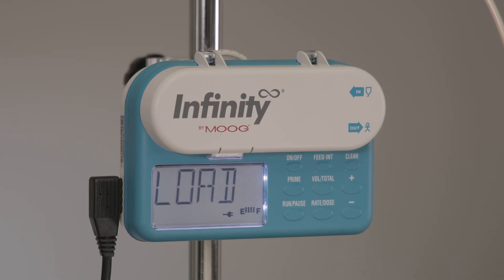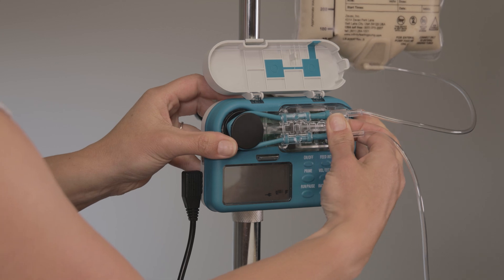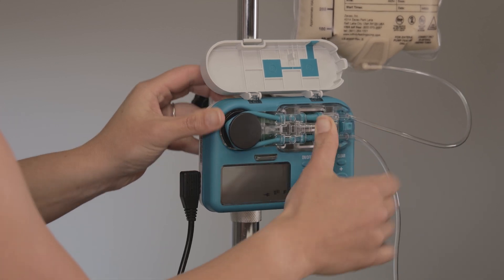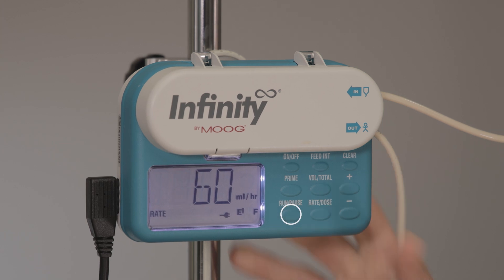If a delivery set is not loaded and the run pause button is pressed, load set is displayed and the alarm sounds. To silence the alarm, press the run pause button, load the set, and press run pause to restart the delivery.